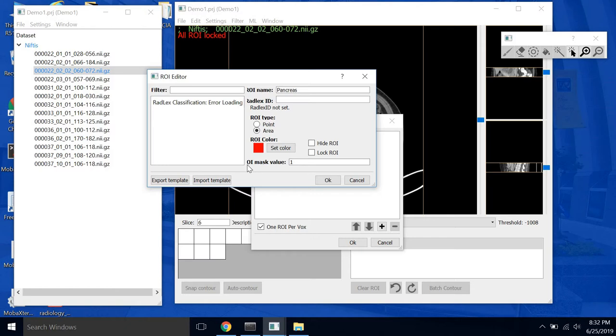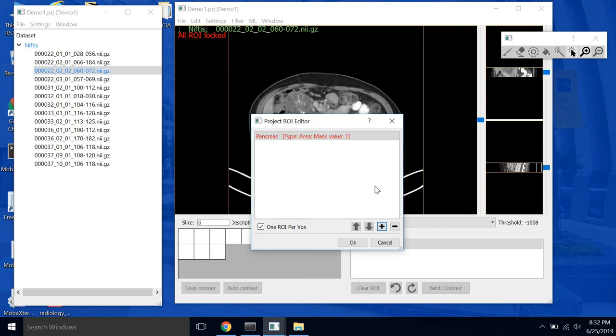And then this ROI mask value. This value doesn't matter except that all of your ROIs have to have a different value. I find it easiest to go 1, 2, 3, 4, 5, etc. So we'll leave this as 1.